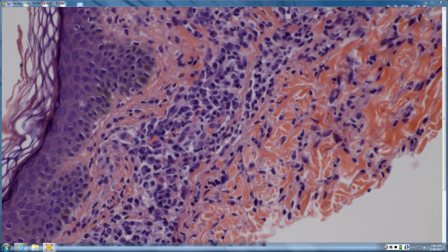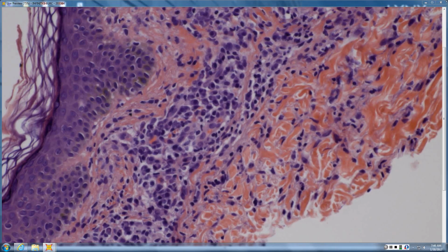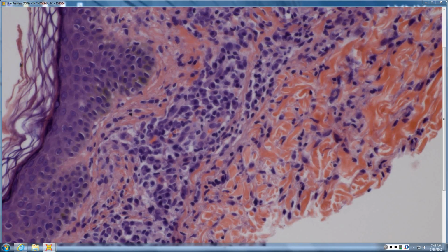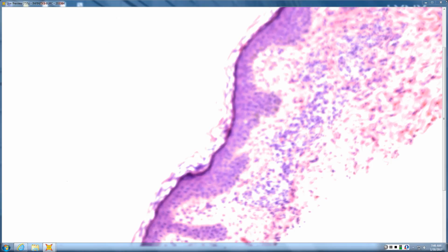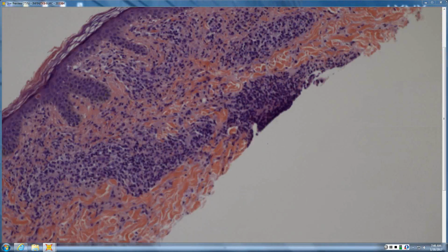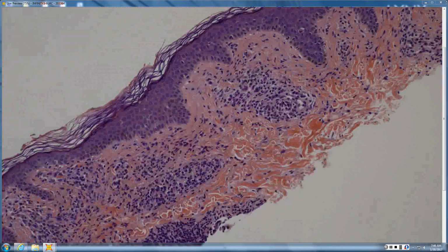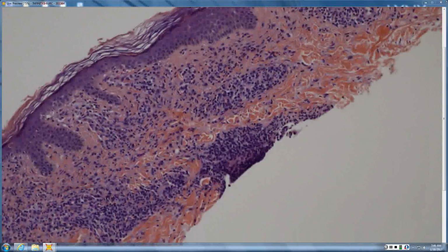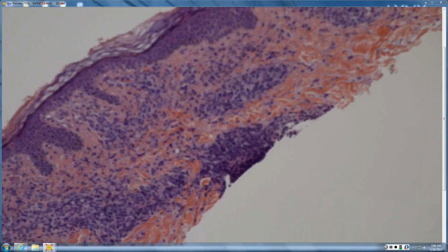They all had an interstitial busy dermis, which is the most common feature histologically. Endothelial swelling, plasma cells present in about 2/3, a little bit of interface dermatitis. You start adding those features up, and they're usually, of 10 to a dozen possible features for syphilis.